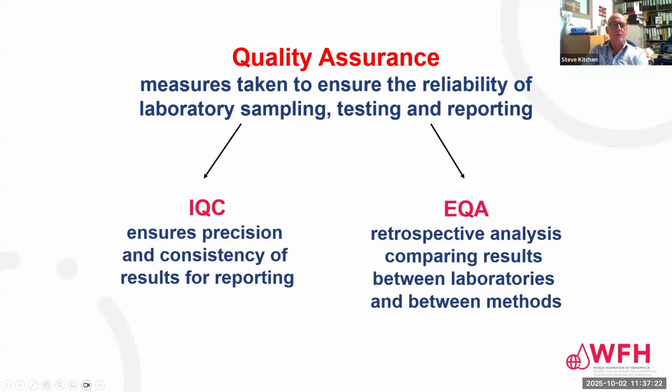Okay, so in this next presentation, I'm going to discuss some issues in relation to troubleshooting issues in coagulation laboratory tests. So I think we should remind ourselves that we need in the lab a quality management system, a quality assurance program, let's say, and that we have two components to this, both of which, in my opinion, are compulsory to operate in the lab.